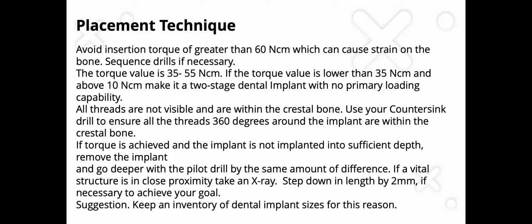If you do see some threads and you're at your final length, what I suggest is to take out the implant, go back in with your pilot drill deeper and your osteotomy former, and get to where you're going. Remember to use your countersink drill because that will ensure that all the threads are 360 degrees into the bone around that implant.